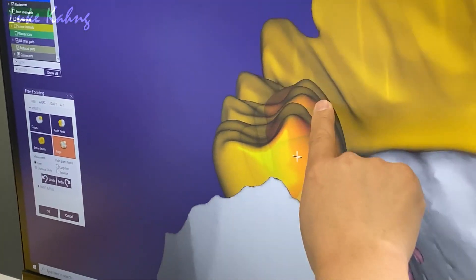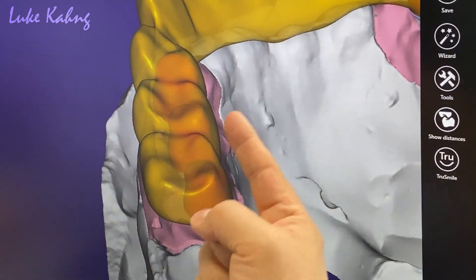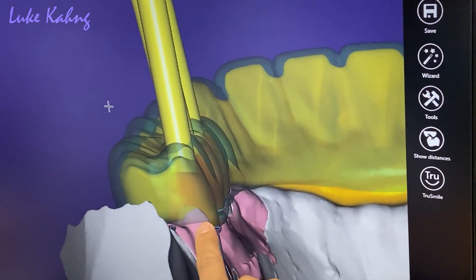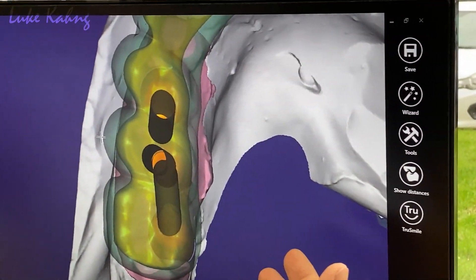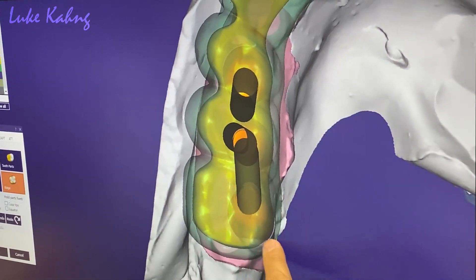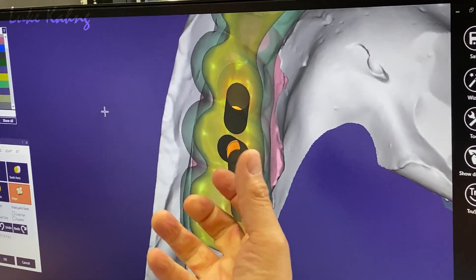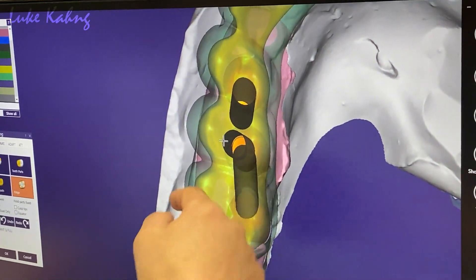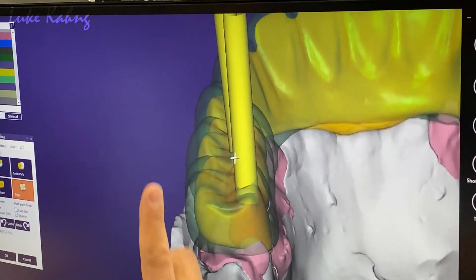What are you going to do? Just screw it here, right? Make the access hole? I don't mind making a lingual bend. Make sense? So we can make the lingual bend — it's a huge lingual bend. Two sides, decrease the size. Then we can make it smaller. And then whenever they bite, it's more evenly spread out.